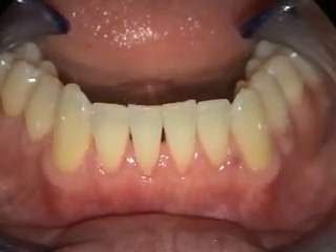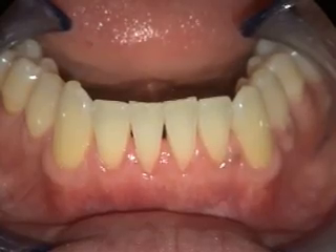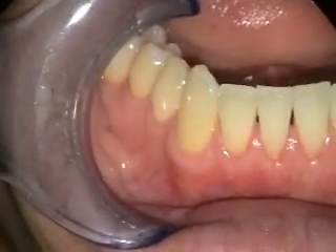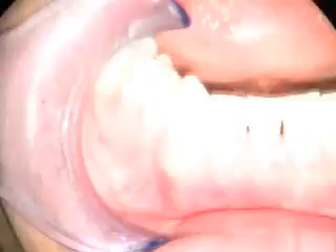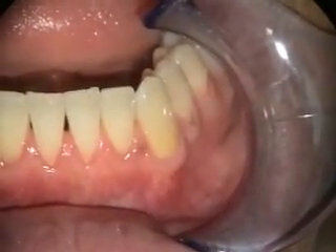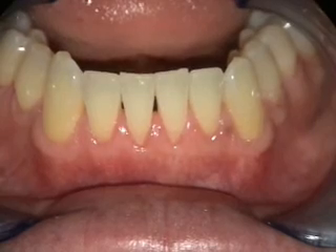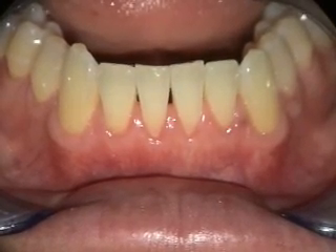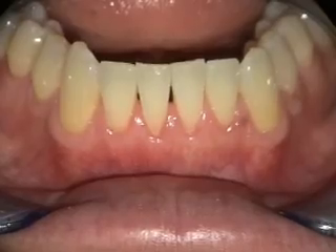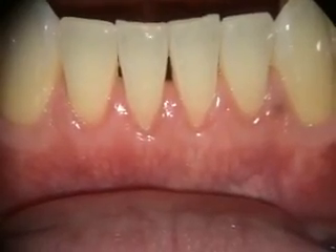This is a two and a half month healing of the alloderm grafting in the lower anterior. Number 27 had about 5mm of recession and that's now totally covered. Number 22 had 4mm of recession and that's pretty much totally covered as well. Numbers 25 and 24 had 3 and 4mm of recession — there's still maybe 1 to 1.5mm of recession remaining, but you can see he's got thicker tissue and at this point we'll just keep an eye on everything.